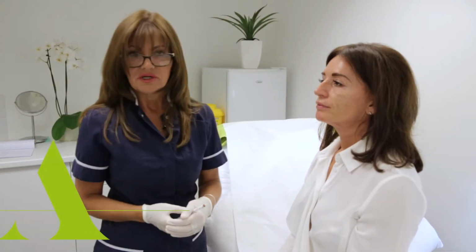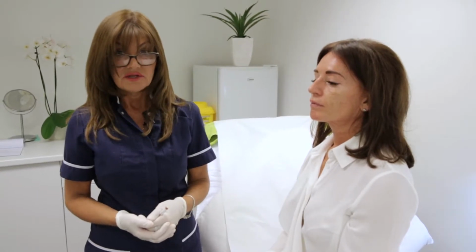The treatment that we're actually doing today on Babs is a treatment called Sculptra. It's a deep tissue filler. What it is, it's what we call a poly-lactic acid, and this stimulates your own collagen growth. It helps improve the skin's texture as well. Over a period of time, she'll get more of a glow on the skin, where the skin looks not necessarily tighter, but a lot healthier.